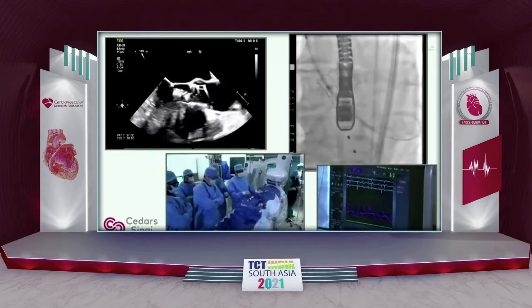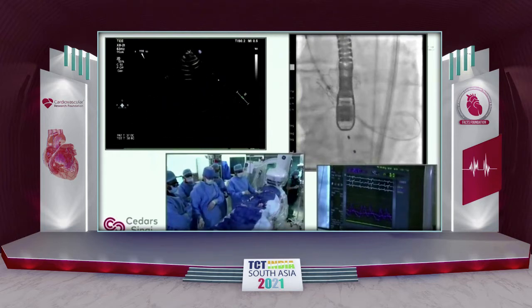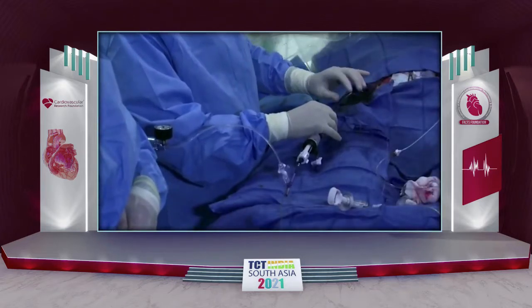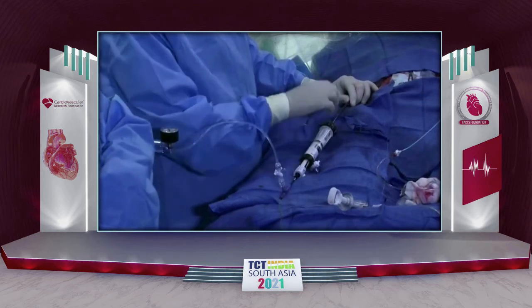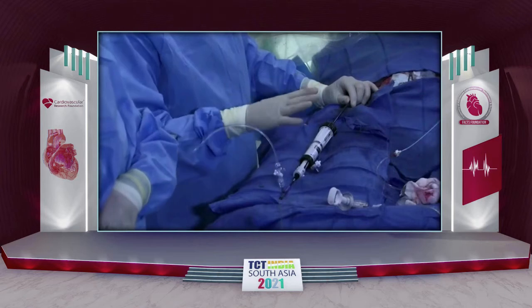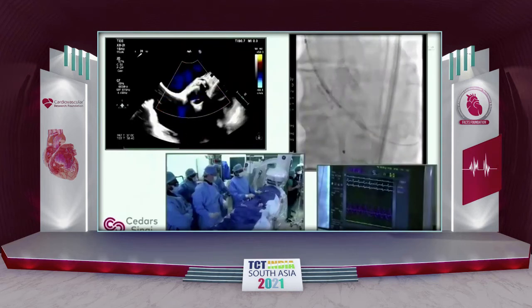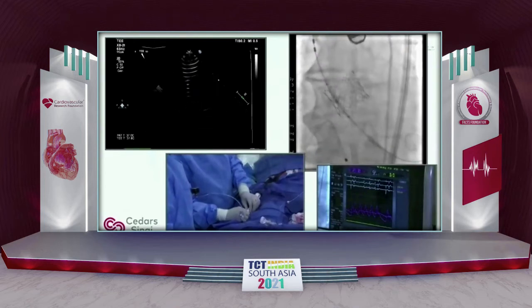Raj, can you describe your hands in the first position when you're deploying? I find that's the most difficult thing. Do you use the knob? Do you push with your left hand when you need to make small adjustments? Yes. I'm just using my left hand, and if I need to, I will push it with the right hand. I'm not using the knob when the rapid pacing starts. We can use the knob to position before the rapid pacing, but I find it so difficult to do anything with the knob. So it's always forward and back with the left hand. That's correct. I agree with you. I don't even use it for original positioning.